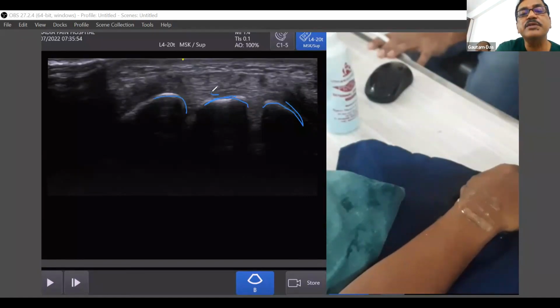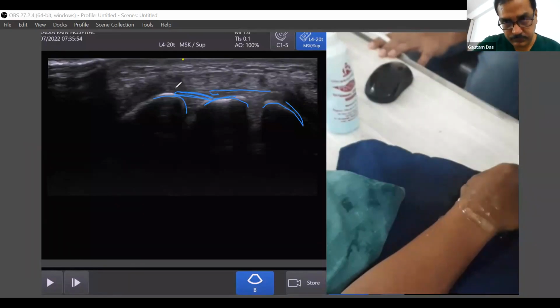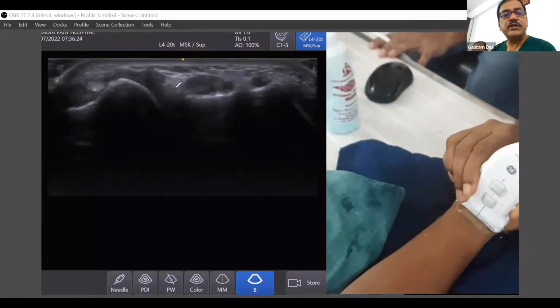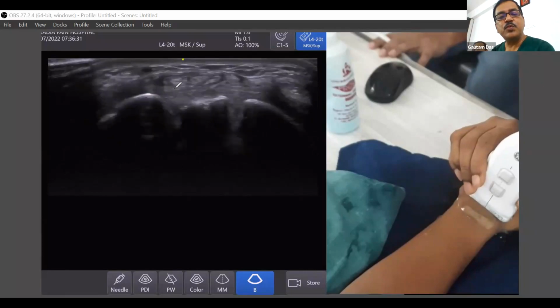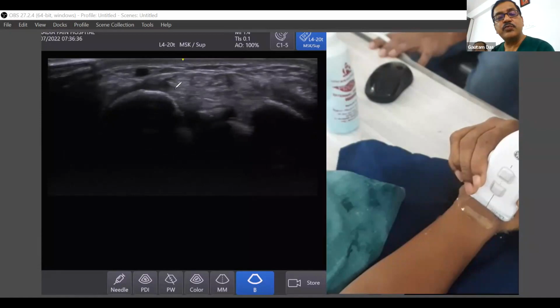And these ligaments, you can see this ligament is your scapholunate ligament. The lunotriquetral ligament is also seen, but again, the visibility is not consistent in every individual. So again, the ulna, the radius, and then again, the three carpal bones are coming. And if I'm going more, you see the lunate is ending, the scaphoid and the triquetrum are still seen.